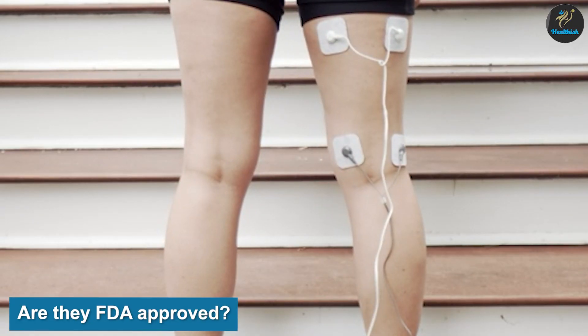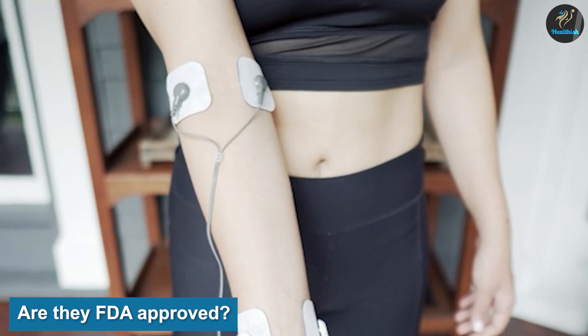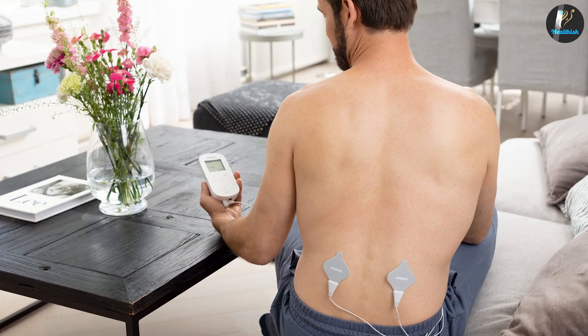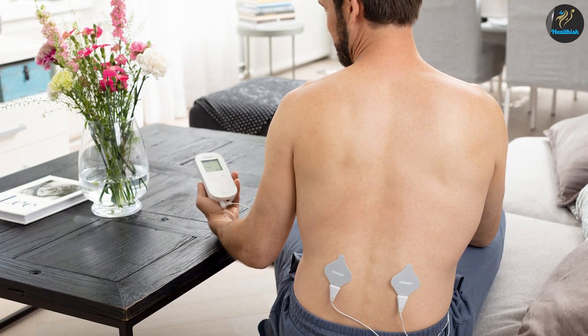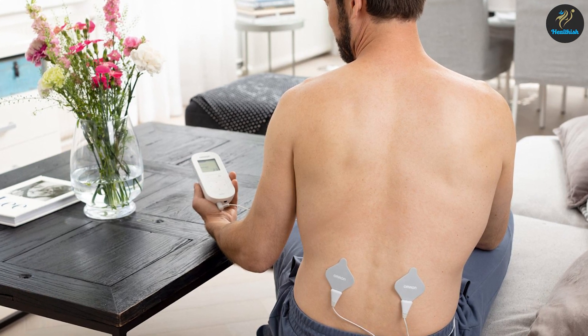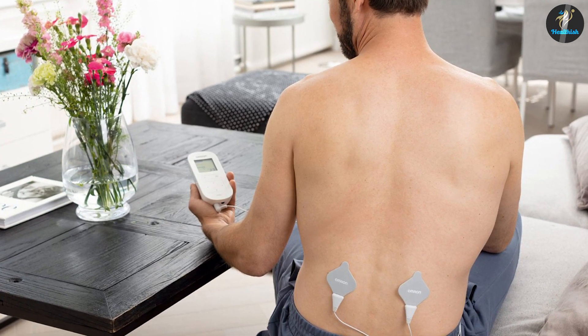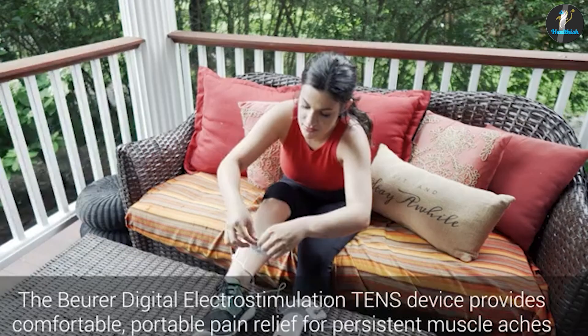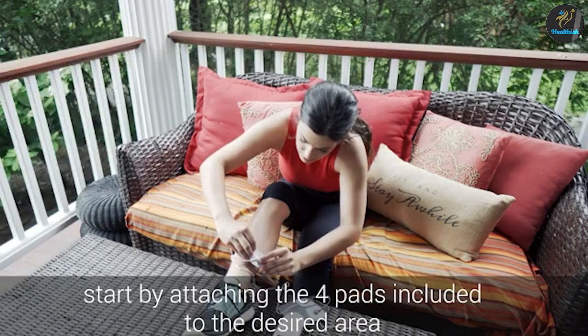Are they FDA approved? The FDA regulates both TENS and EMS machines, which are considered medical devices. This means that manufacturers of these devices must meet certain standards to sell them legally. Also, sellers cannot make false claims about the safety or effectiveness of these machines. TENS and EMS units that do not meet the FDA standards are illegal and are more likely to pose safety risks.